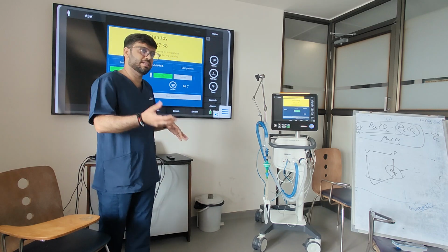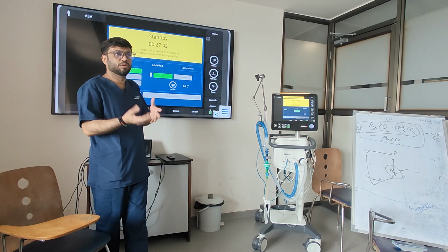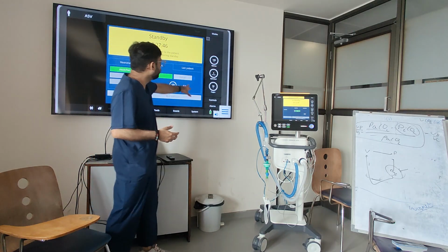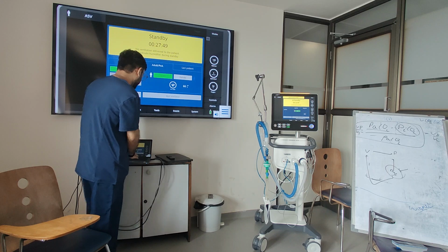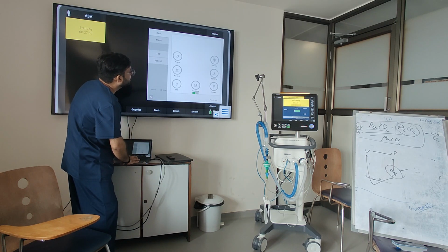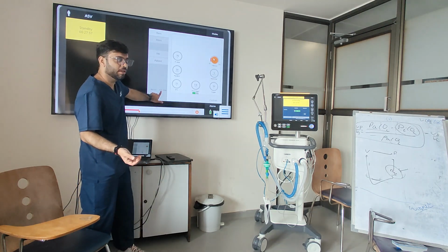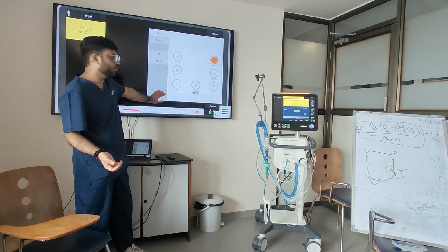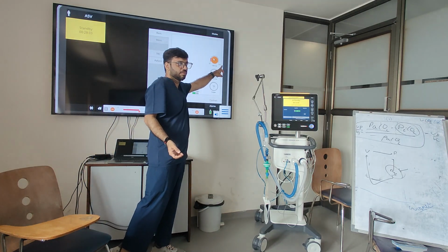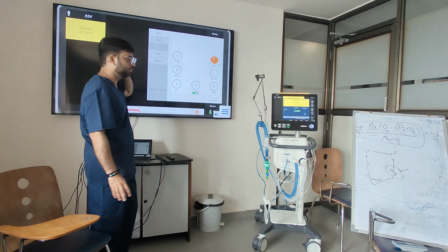But suppose, as I said, you have a difficult patient, not with hypocapnia, but with fever or a metabolic state, and you want to target more minute volume. Then as per your target minute volume, you can change the percentage minute volume from 100 to a little bit more. If you want to give more than 6.6 liters, it is in your hand. The limit is still 350. So the only way is to jig the system and make it more complex.